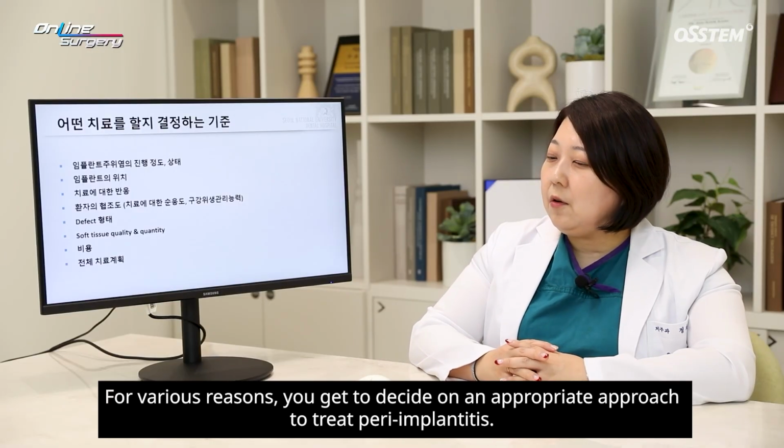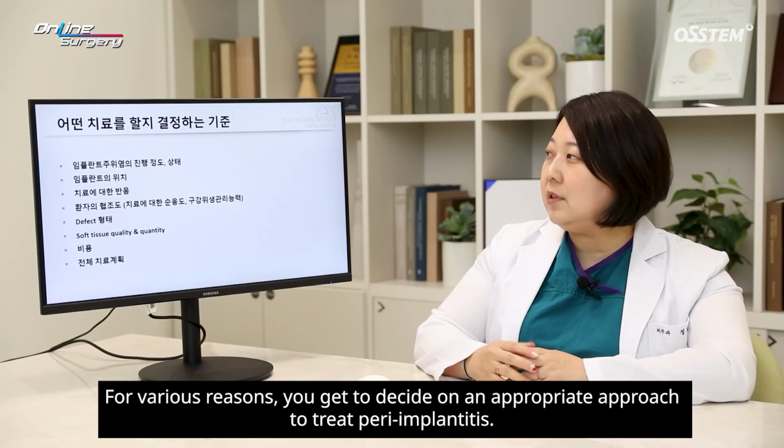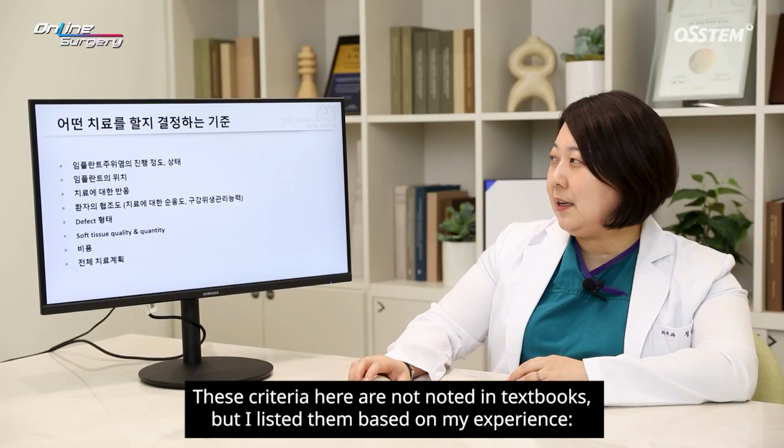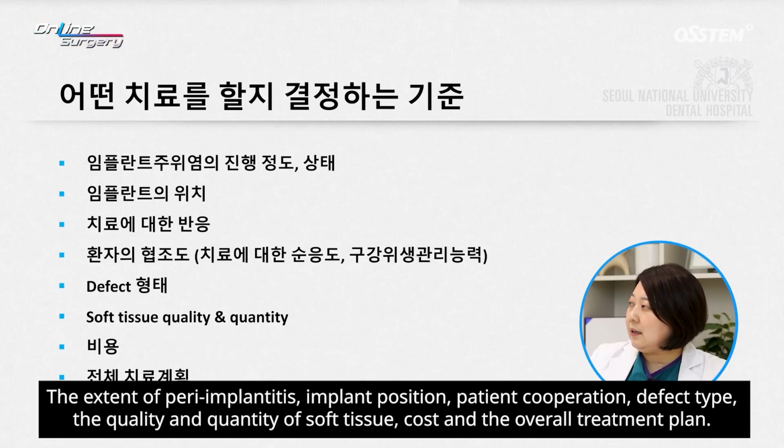For various reasons, you get to decide on an appropriate approach to treat peri-implantitis. These criteria here are not noted in textbooks, but I listed them based on my experience. The extent of peri-implantitis, implant position, patient cooperation, defect type, the quality and quantity of soft tissue, cost, and the overall treatment plan.